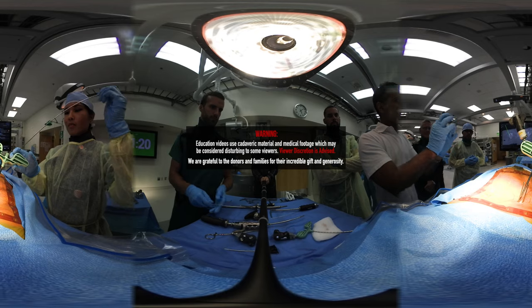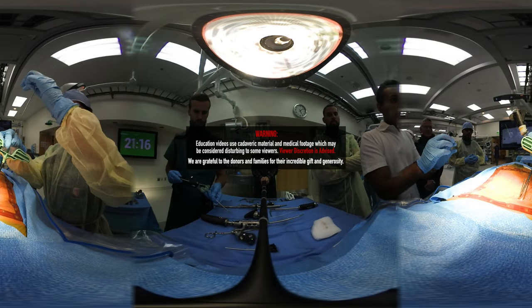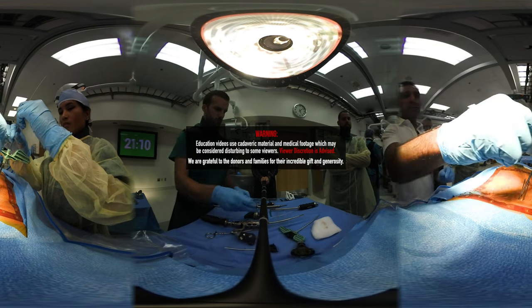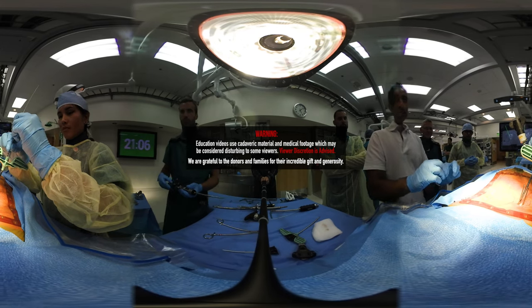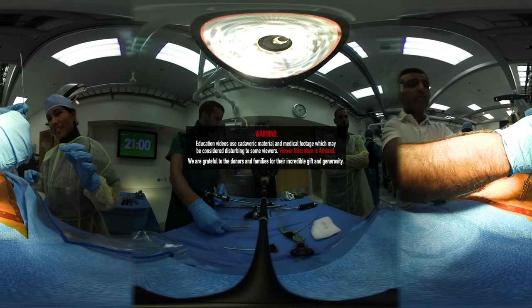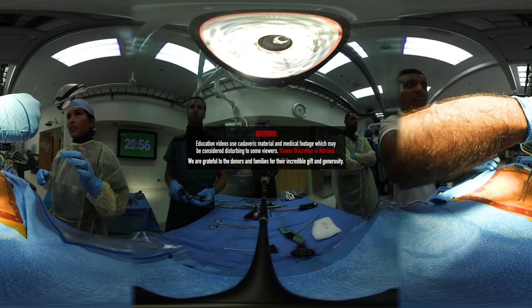Take the guide wire. You're going to put the guide wire in and you want to feel bone. So you're going to go really gentle. You feel bone? Yeah. So now you're going to have to a little bit more aggressively push to break the bone with your guide wire to push it in. Is it going at all? Do you feel like it's actually going in? Not really — it's like bending. No, you're in. You're in. The fact that I can't just pull it out is a good sign.